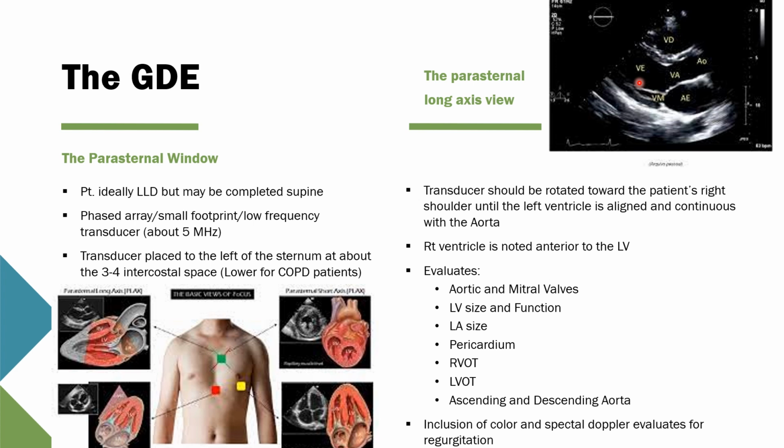Now, each step you go farther into this makes it less and less goal-directed, so most physicians are going to use this on a very basic level. If they want that additional information, then they'd be referred on for a full echo.